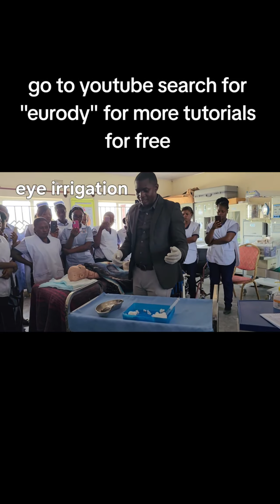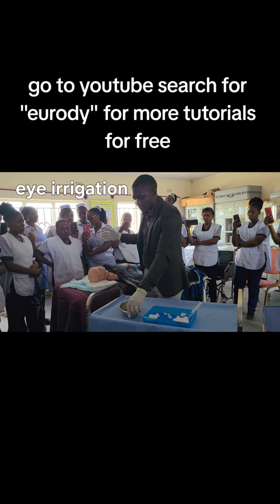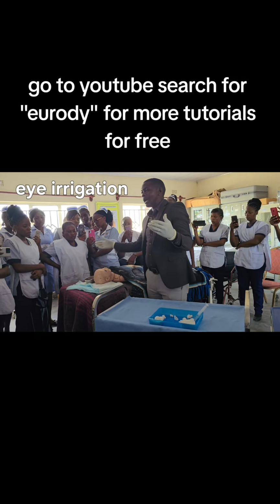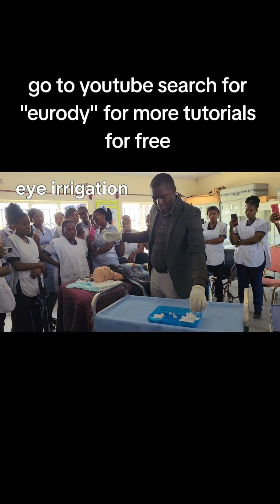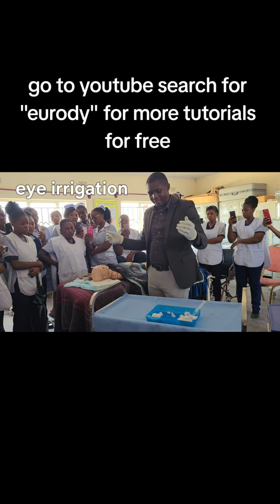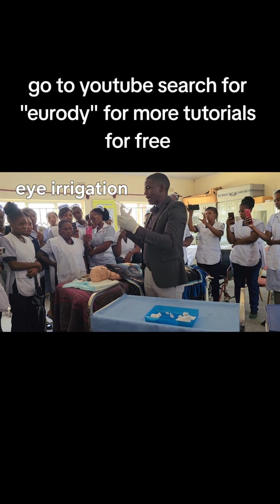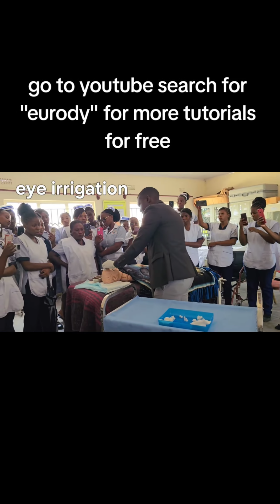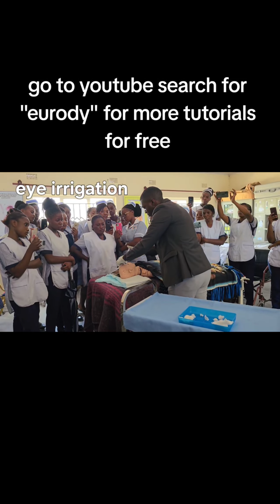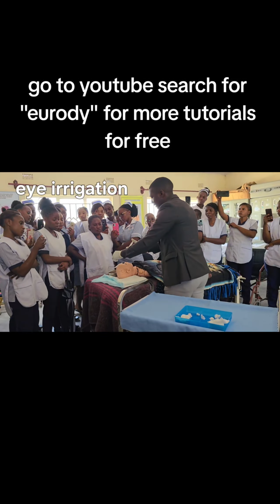Okay, so afterwards, you are going to say, Mr. X, I'm back to clean your eyes. Then you get the receiver. You place it on the furthest eye. Then from there you get a gauze and you drop it on the furthest eye like that. Then you pick the syringe and pass it on to this hand. So Mr. X, you can just tilt the head to the right. Then you push in the fluid from the inner part of the eye to the outer part.